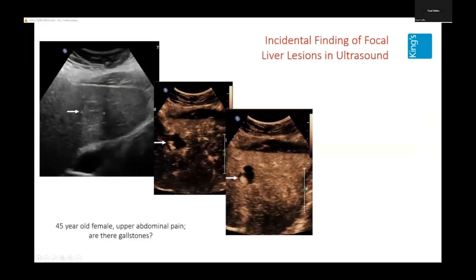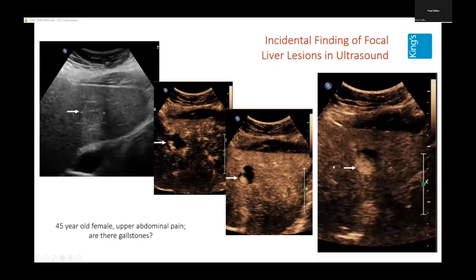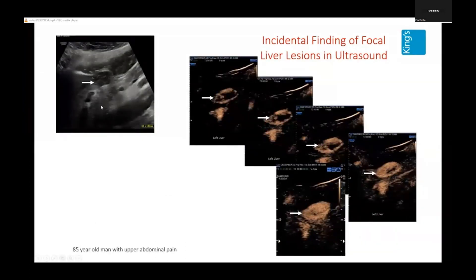Here's another patient — a 45-year-old with upper abdominal pain asked to check for gallstones. There is a very atypical lesion in the lobe of the liver. After contrast injection, globular enhancement in the periphery is pathognomonic of a hemangioma, and you can watch that infilling over time. You don't need to investigate this anymore. This is an atypical hemangioma — and the expectation is that over the next few years it will probably appear very typical.